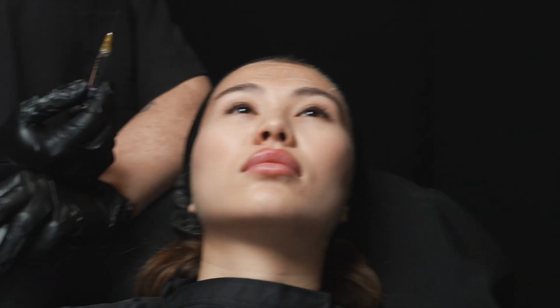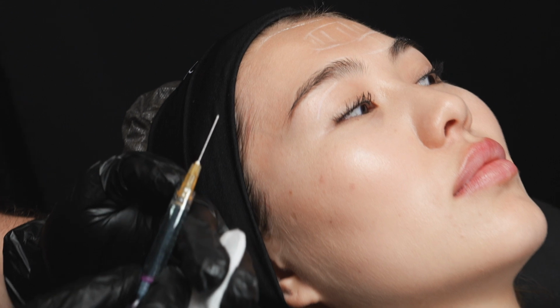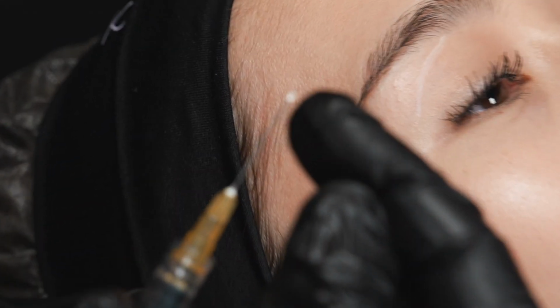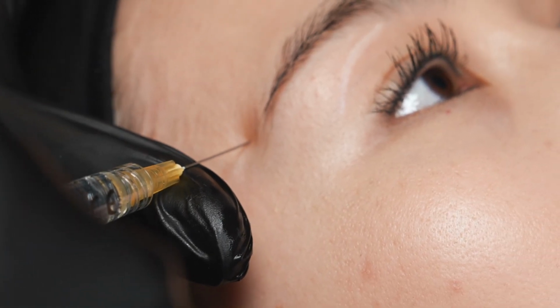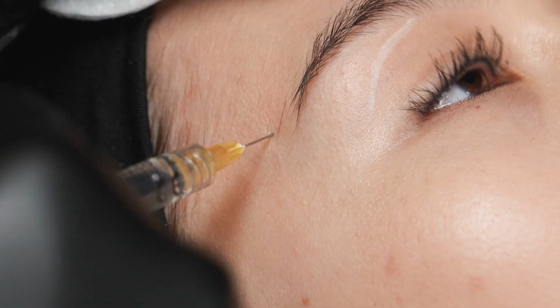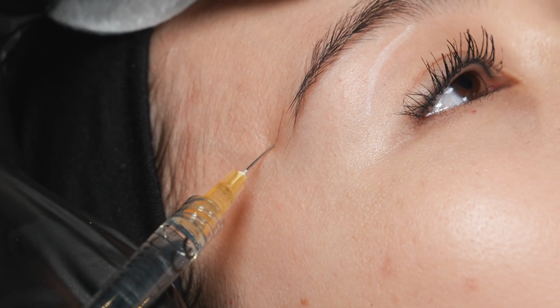Я вам говорила уже о том, что продукт, с которым я работаю, RHA4, длинная игла. Я хочу вам показать, как она устроена. Вот. И я проверяю свою иглу острием вниз. Да, все чисто. Я проверил вены. Итак, я под 90 градусов захожу в глубокие ткани. Итак, достиг надкостницы. Мне не нужна слишком длинная игла.